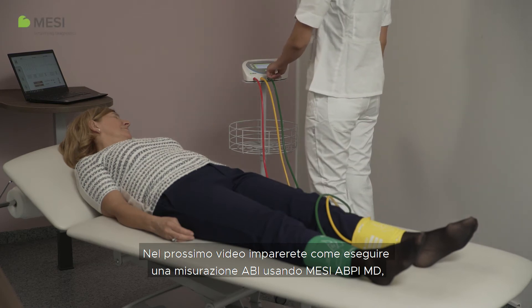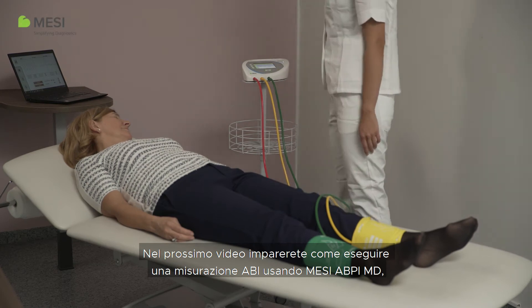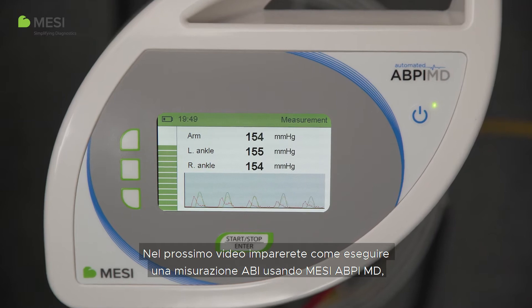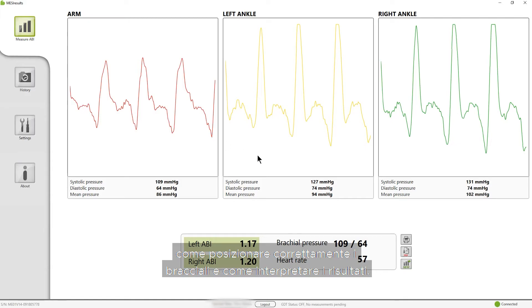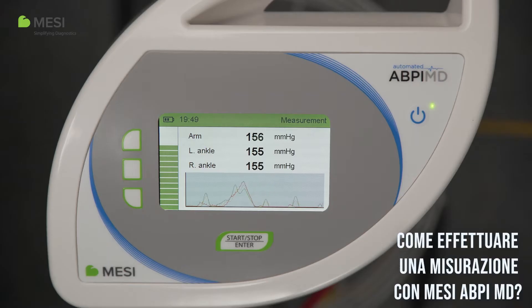In the following video, learn how to perform an ABI measurement using MESI ABPI MD, how to place the cuffs correctly, and how to interpret the results. How to perform a measurement with MESI ABPI MD.